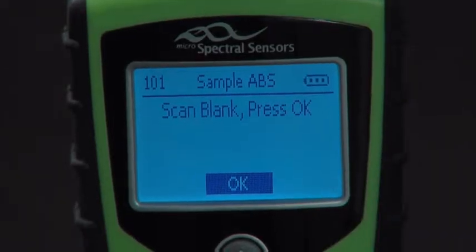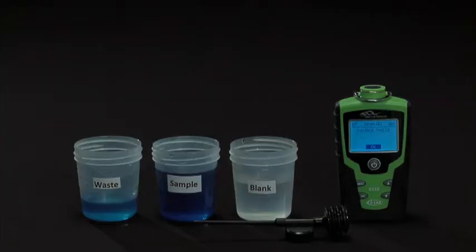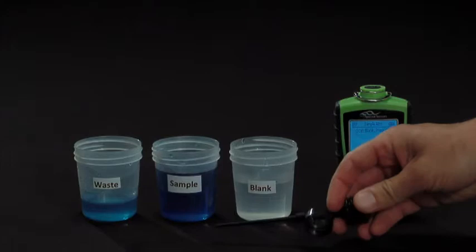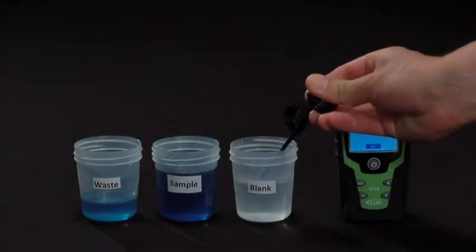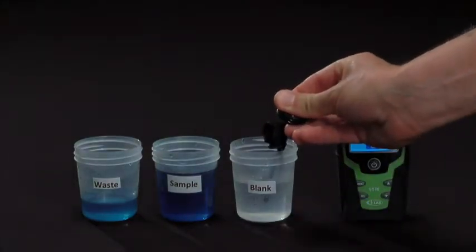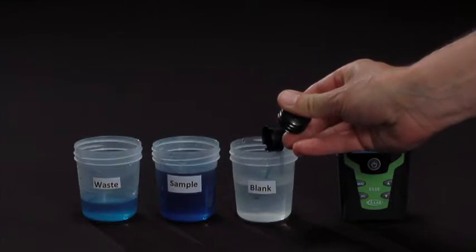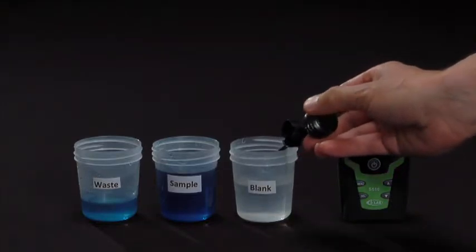The first step in the method is to scan a blank. Using the Samplet, we'll dip the tip of the Samplet into the blank, depress the bulb approximately three-quarters of the way, and slowly allow the bulb to expand and draw the blank into the chamber.